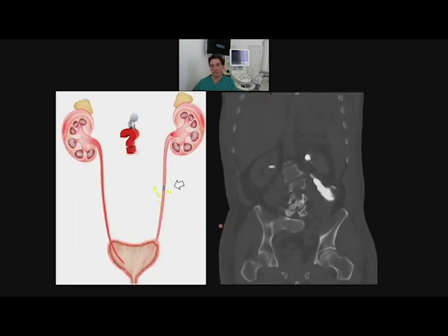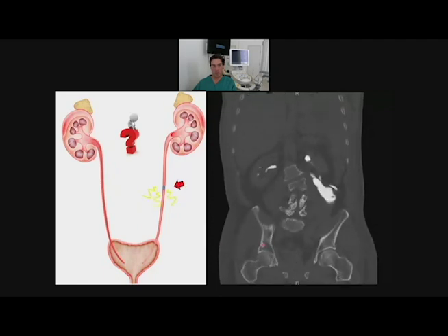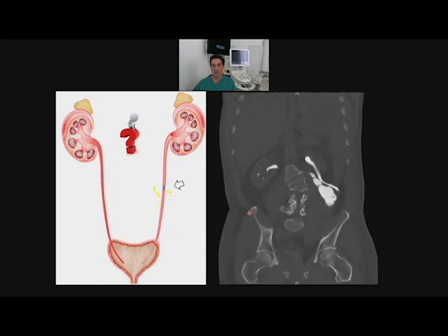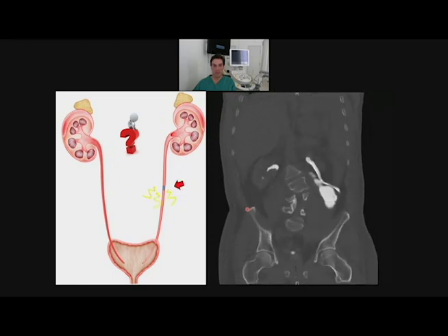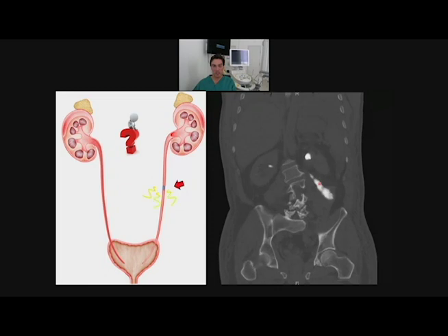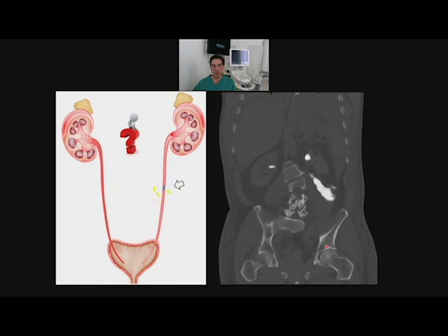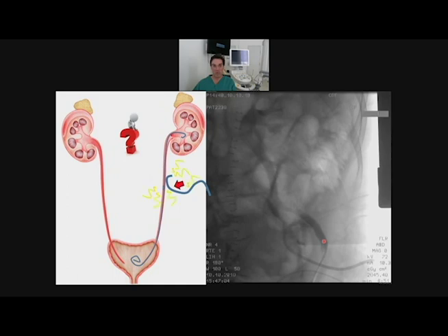See an interesting case that is horrible. That was a man, he had a neurogenic tumor, and his ureter had a length of 36 centimeters. It was in frontal side of the tumor. The tumor was partially reduced by chemotherapy and radiotherapy, and they had a problem that they had three leakages inside of the ureter nearby the tumor. What did they want to do? Only a normal double J is not working. So what we do now is to put a real stent inside.